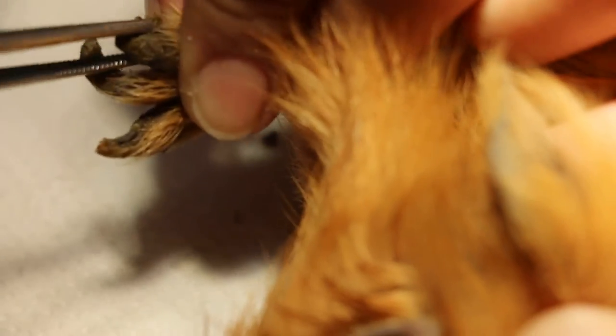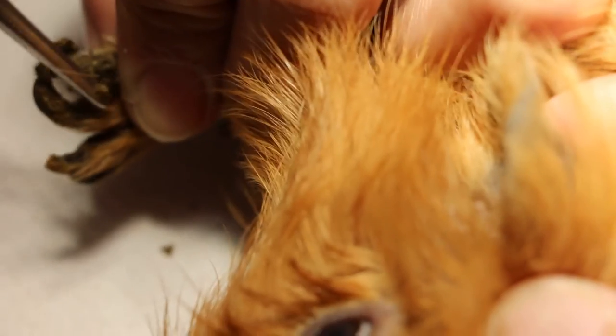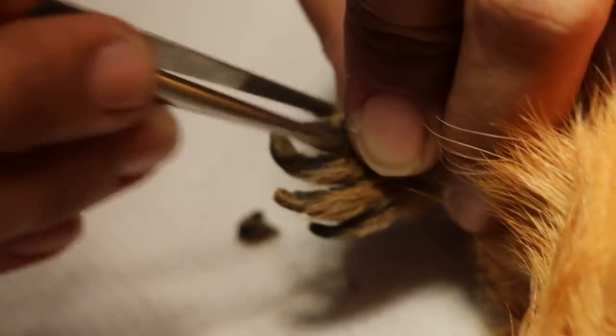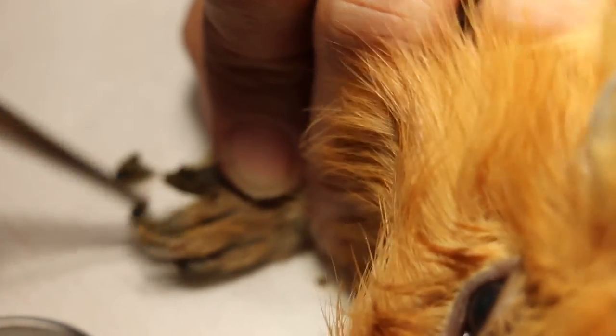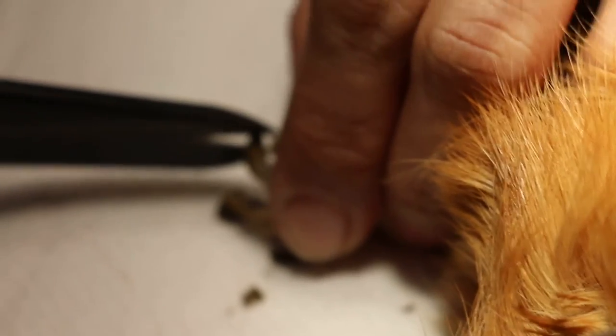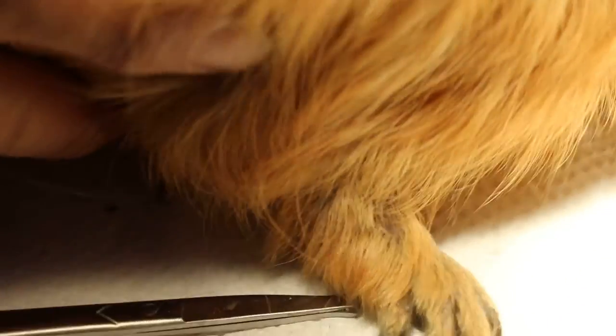Is it an abnormal cloth or so? No, this one is dirty — due to dirt and stools. A lot of stools stuck inside, encrusted with stools. You can send for grooming. Okay, finish — check, right? You see that my assistant's hands are full of stools.